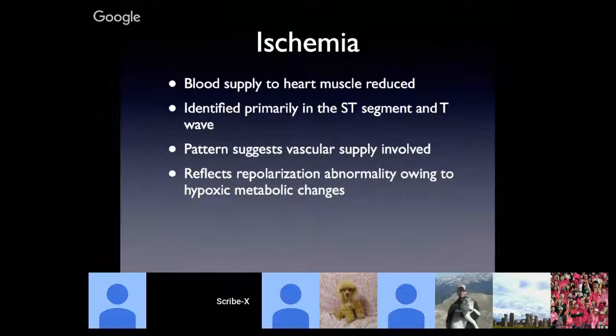And what it really represents is the T wave and the ST segment are where the heart's relaxing, right? So this will be a problem with repolarization, or a problem getting the ions that just migrated between sides of the cardiac myocyte membrane back into position. So if your heart doesn't have the energy to do that, for instance, because it doesn't have enough oxygen, then repolarization will be disturbed. And you can tell that on the EKG, and we call that ischemia.